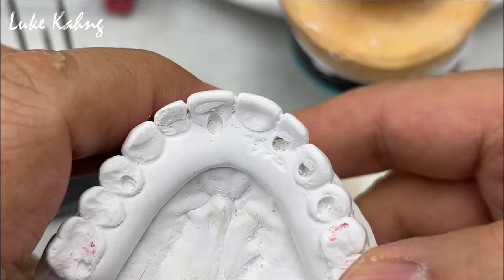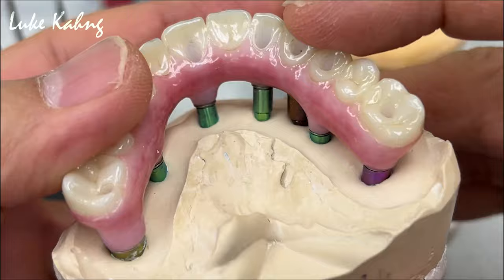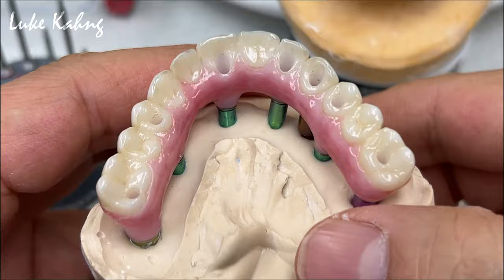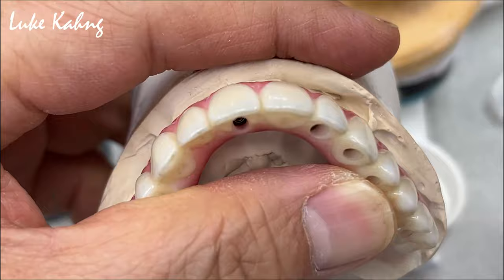And there's maximum cementing between the tooth like this. Okay, now just make sure there's no rocking. All right, so it's very essential. So we're using the cement, which is slow-setting Panavia, but if I'm using a fast-setting, then I use GC cement. So here I'm using the Panavia slow-setting because it's 7 implants, especially with 3 angle screw channels, the facial one we bring back. And then we fabricated all monolithic, and the monolithic is stronger, so I don't want cracking.